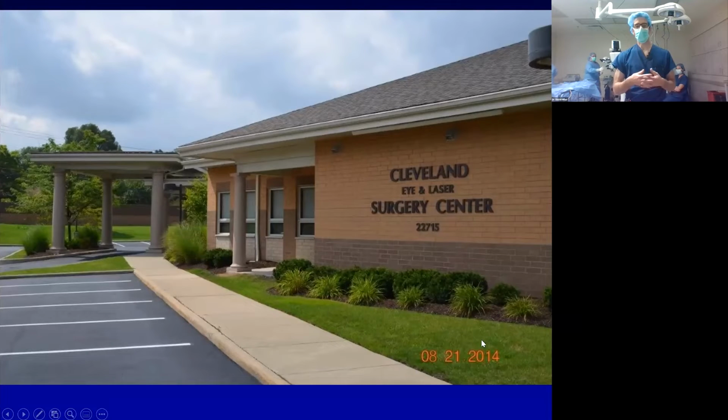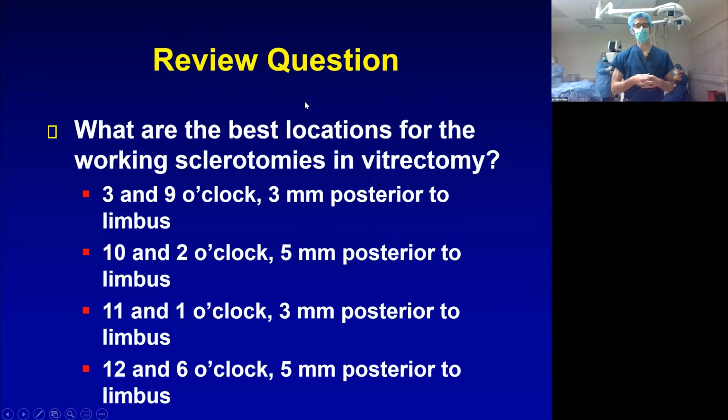And next slide. So here we are at the Cleveland Eye and Laser Surgery Center. I'm going to start with the review questions that we'll go over again at the end of the talk. What are the best locations for working sclerotomies in vitrectomy? You can pick your answers now. We'll review them later at the end of the surgery.